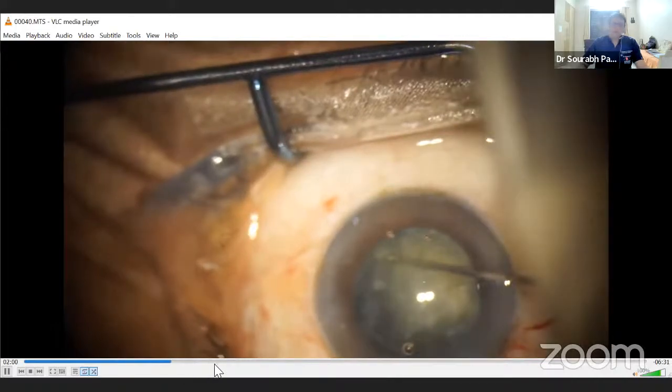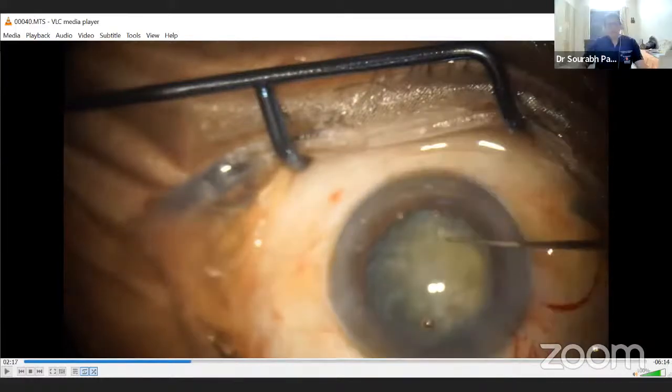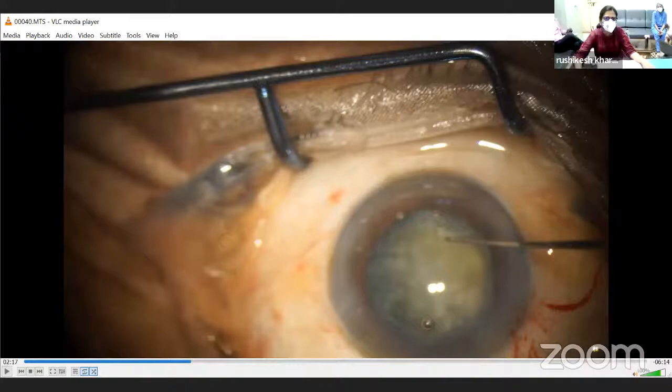This nucleus is already tilting. Yes, sir. So you tried chopping or you didn't try chopping? I tried chopping, sir. That part of the video is not there.